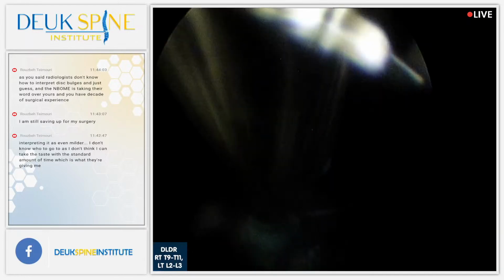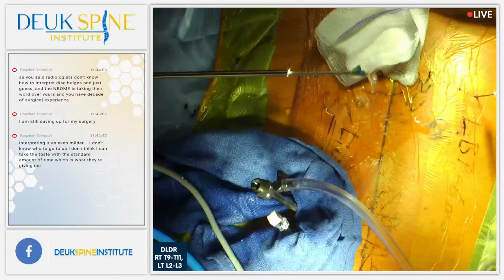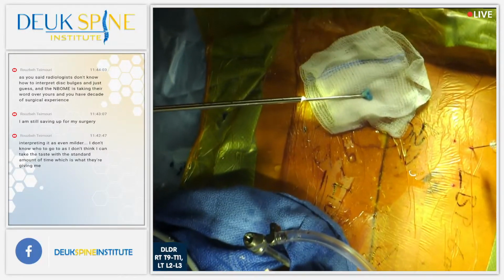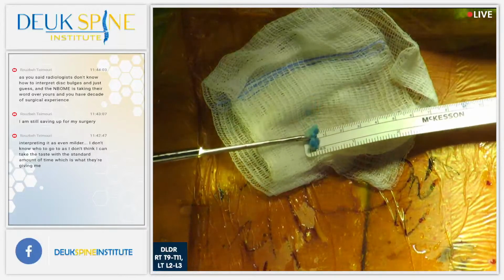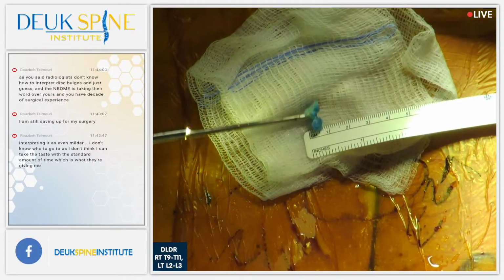Another herniation. Wait, get a picture of this. Turn on the lights. You guys got to see this thing. You guys see this? It just came out? Yes, we do. Henry, you see this thing? Yes, we do. All right, bring the tape measure. Thank you, Luis. Put it right there. You guys see how big this thing is? Yes, we do. That is at least 1.5 centimeters long, and it's thick.